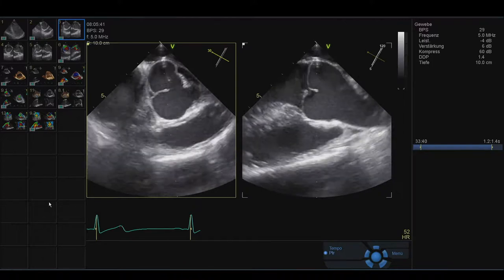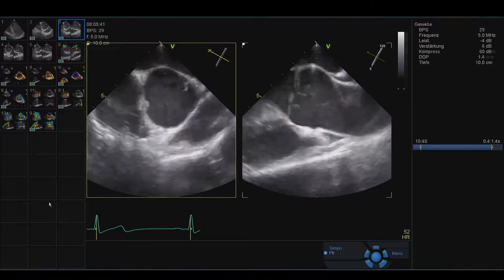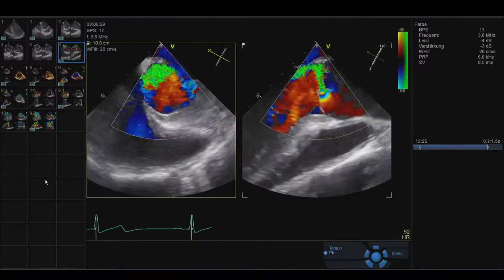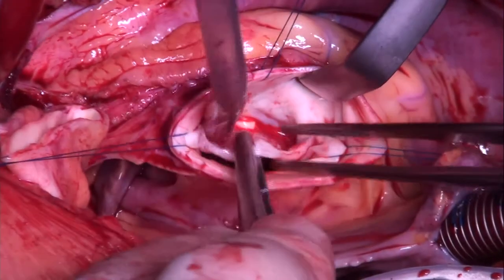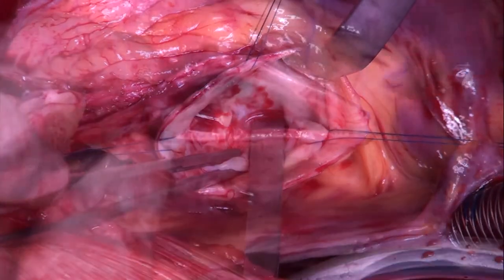This 46-year-old patient has a bicuspid valve with roughly 160-degree orientation. There is prolapse of the fused cusp and relevant regurgitation. There is complete fusion of right and left cusps, and there is muscle in the left and right sinus.